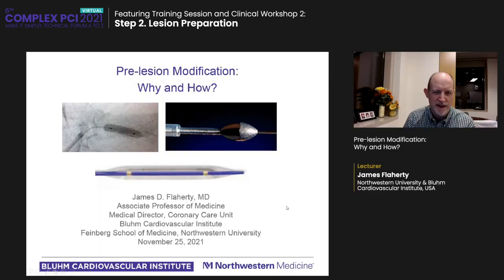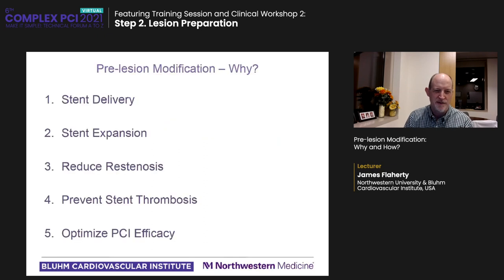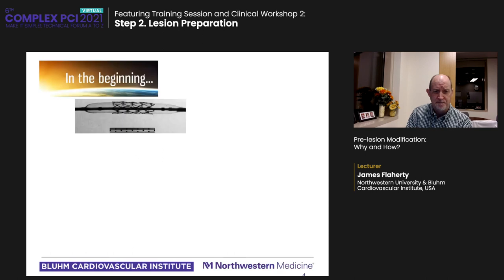James, please. So I'm going to talk about pre-lesion modification, nothing to disclose. And why do we modify lesions before stenting? Well, the number one reason is to deliver a stent and to expand a stent, reduce restenosis and thrombosis, and also to optimize the efficacy of PCI.